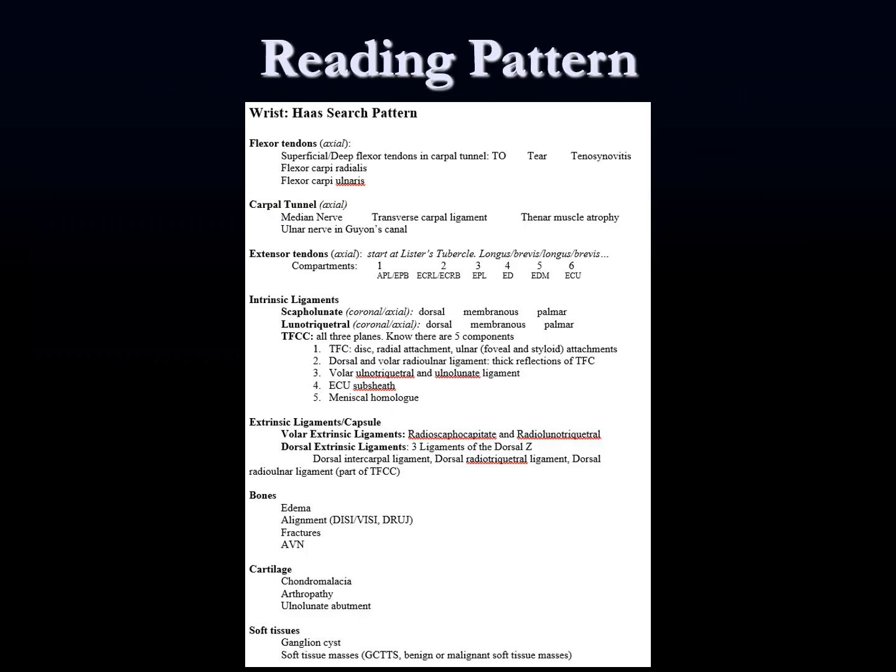This is the reading pattern. It goes down and starts with tendons, then goes into ligaments — so it's sort of an outside-in approach — and then finally at the end, bones, cartilage, soft tissues. We'll just take one by one and go through all the anatomy, hopefully with pretty good scrollable images. I did try to find a pretty normal study — it was a little harder than I thought; I'm always on the lookout for good normal studies on young people.